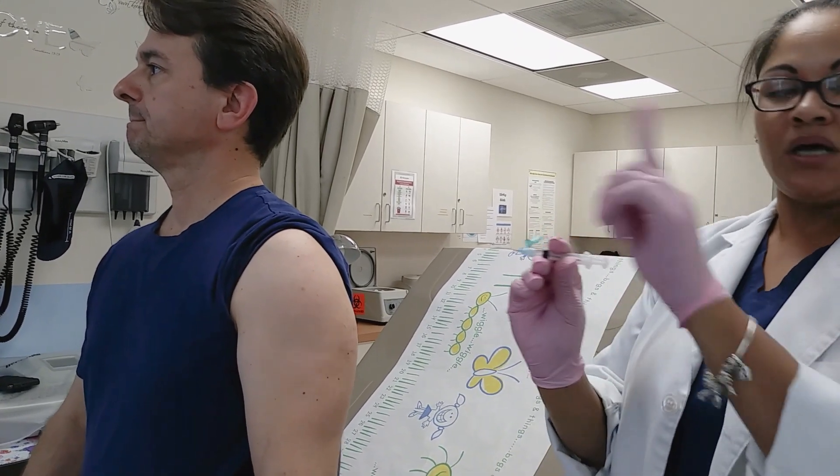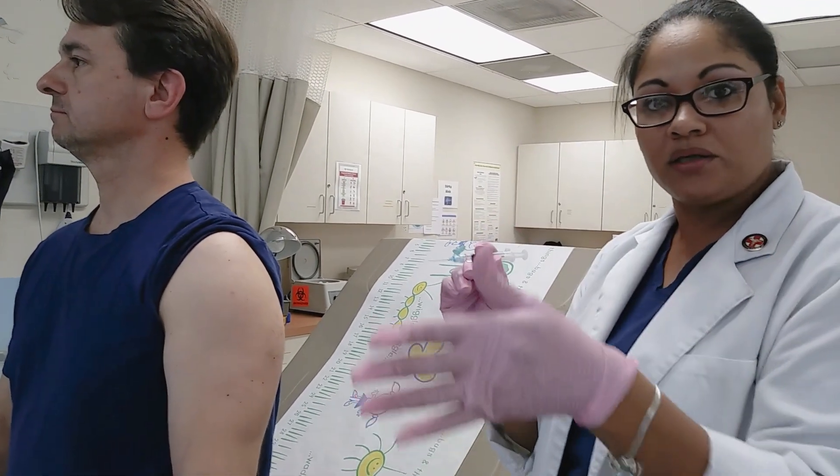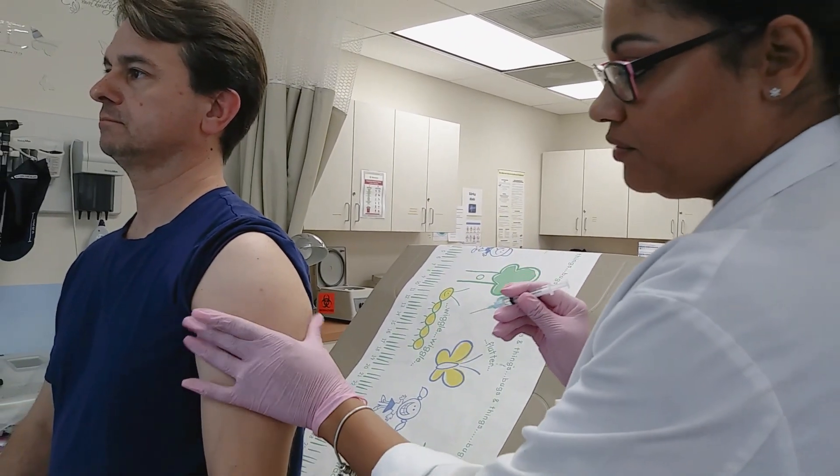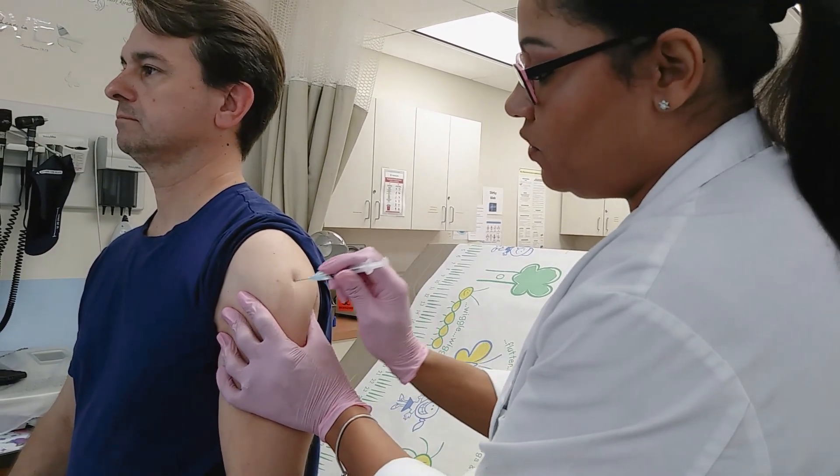We're going to make sure our bevel's up. I always keep you in the habit of keeping your bevel up — this goes with injections as well as punctures. We're going to give counter pressure, then go straight in nice and quick. Whole needle all the way in.